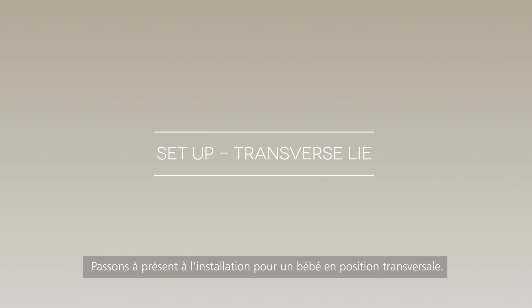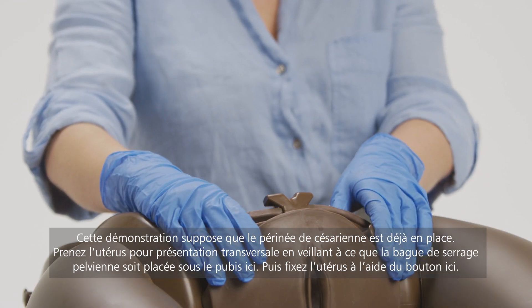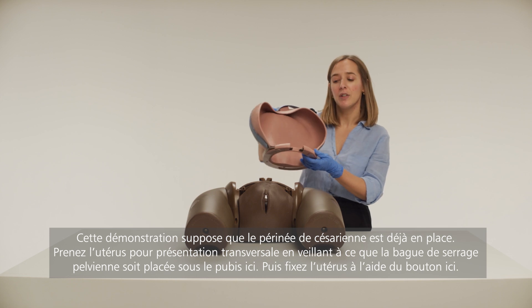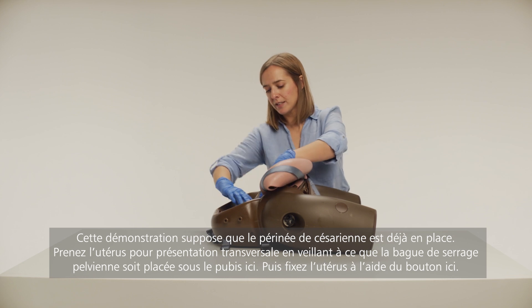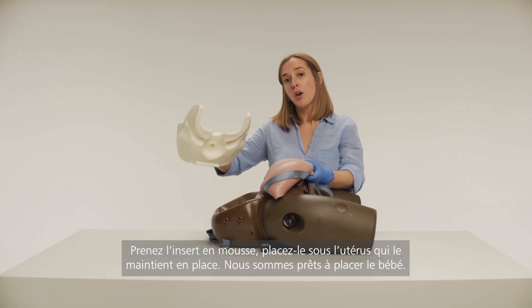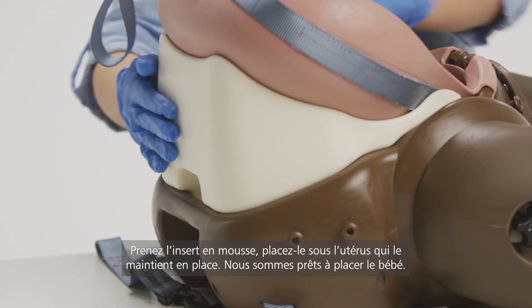We'll now walk you through the setup process for a baby in the transverse lie position. This demonstration assumes that the C-section perineum is already in place. Then take the transverse lie uterus, ensuring that the pelvic ring clamp clips under the pubic bone here. Then secure the uterus in place by twisting the knob here. Take the foam insert and place it under the uterus, which supports it in its place.